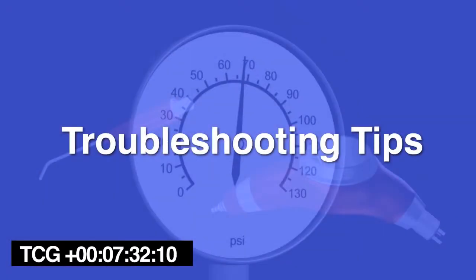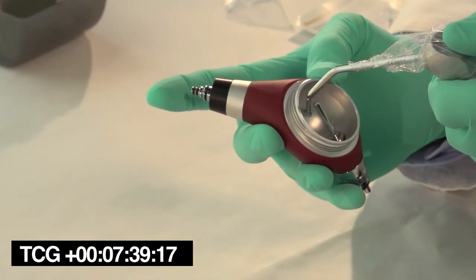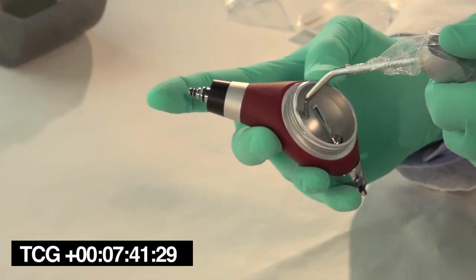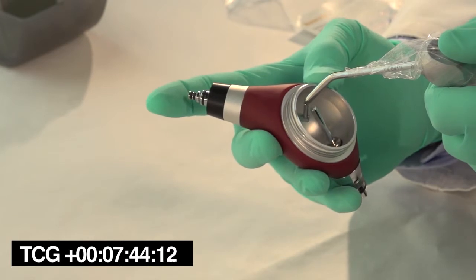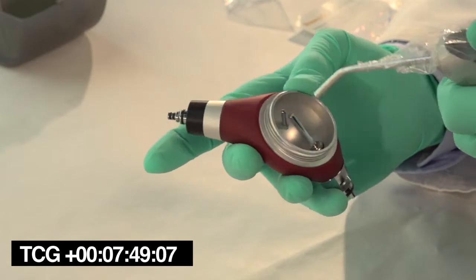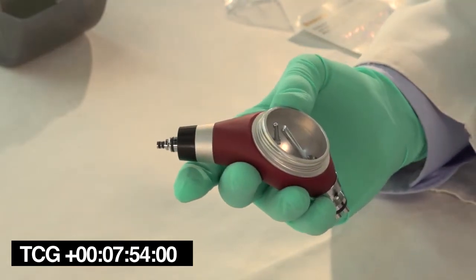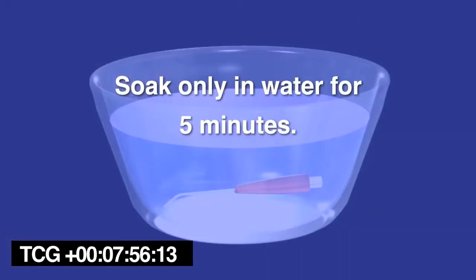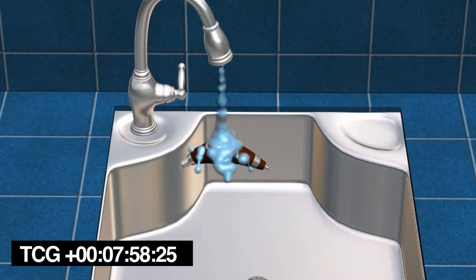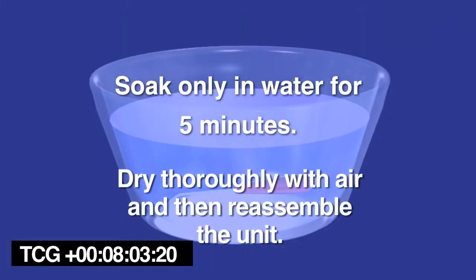Troubleshooting tips. If your air polisher becomes clogged, we recommend the following steps. Step 1. First, find where the clog is actually located by removing the nozzle from the air polisher body and seeing if you have air and water exiting. If you do, then the clog is located in the nozzle. Tip 1. If the body is clogged, fill the reservoir with hot water for 5 minutes and then remove the water. Dry thoroughly with air and reassemble the unit.